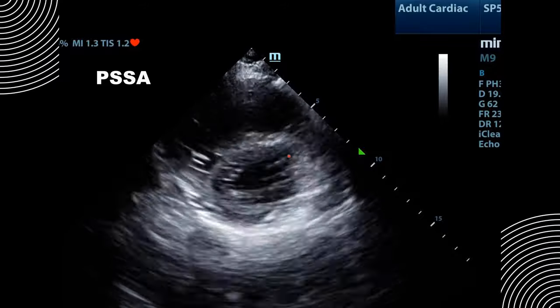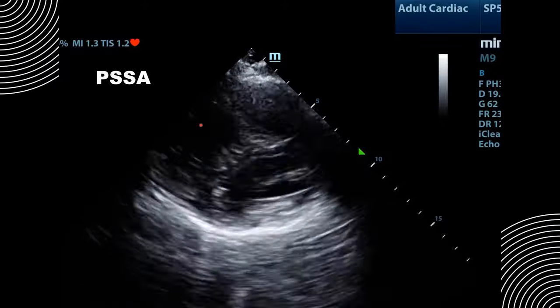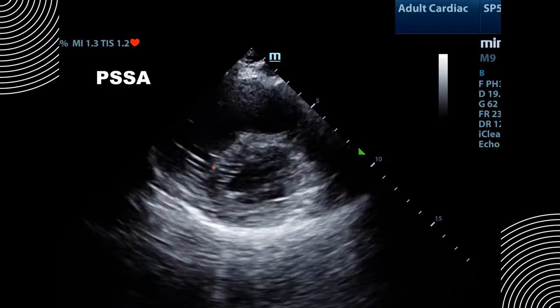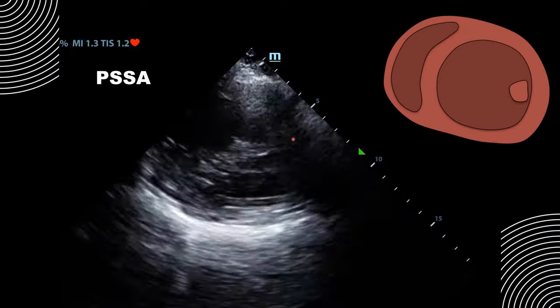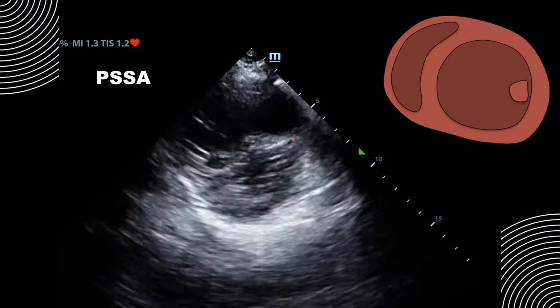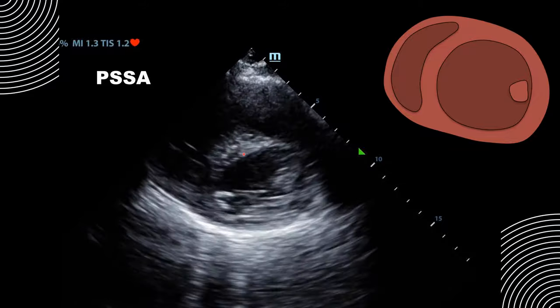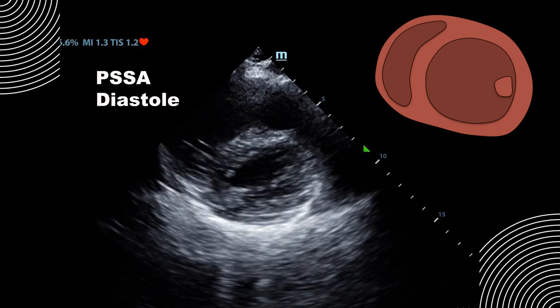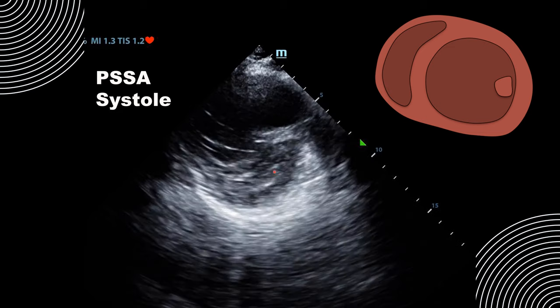In the parasternal short-axis view, we should have a circular left ventricle and a small crescent-shaped right ventricle. Notice that the RV is quite large and actually flattens the interventricular septum at some point in the cardiac cycle. When you go into systole, the interventricular septum is flattened, creating what we call the D sign — a squished left ventricle that looks like the letter D.